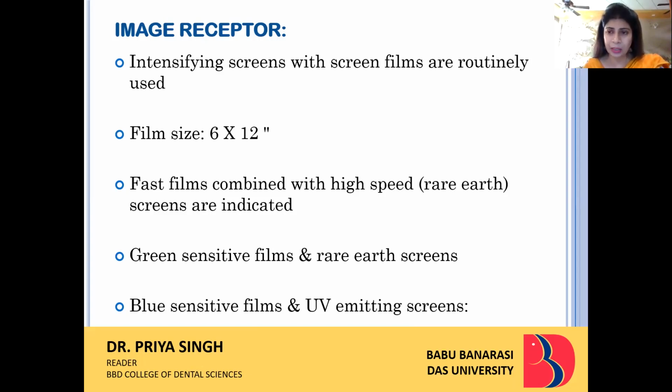All these aspects are very important because, being an extraoral radiograph, we suspect or we know that there'll be too much radiation exposure by all these means. That is the intensifying screen's presence, fast film, because the exposure will be minimal, and exposure time will be reduced with high speed. All this will reduce the X-ray exposure in the individual to be minimal. The green sensitive film and rare earth screen will further intensify the effect of the X-ray that is cast on it, and the image will be optimum. Without much radiation exposure also, you will get an image of good quality.